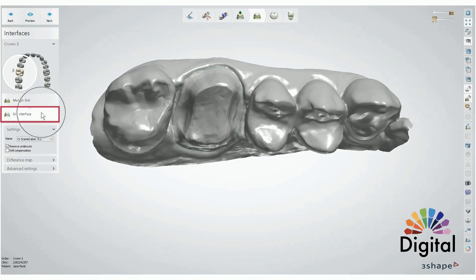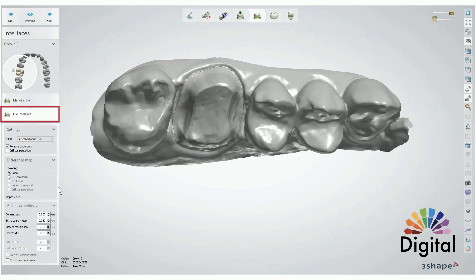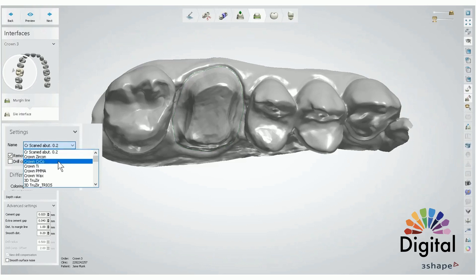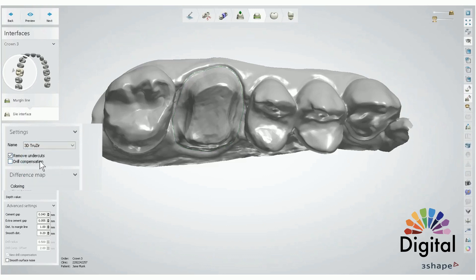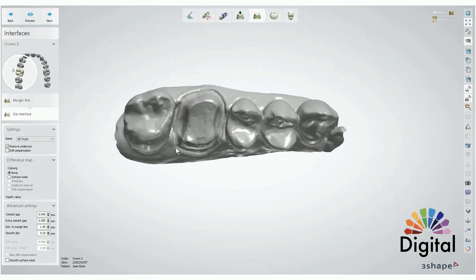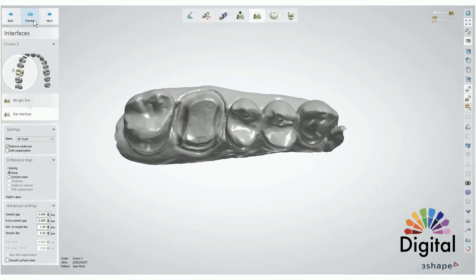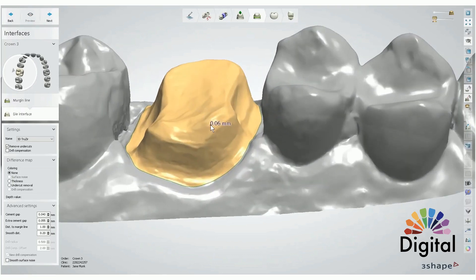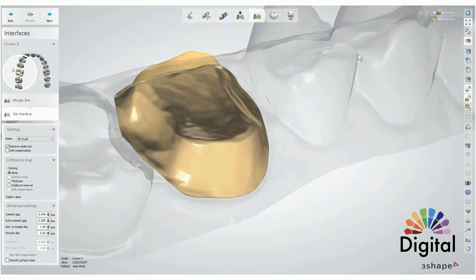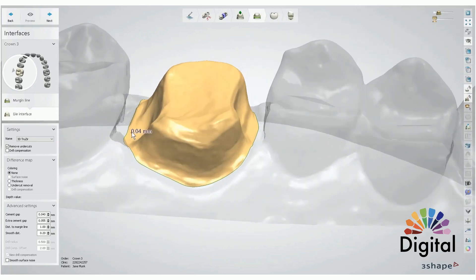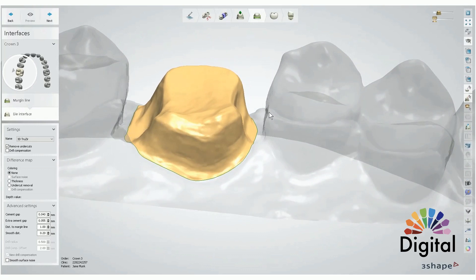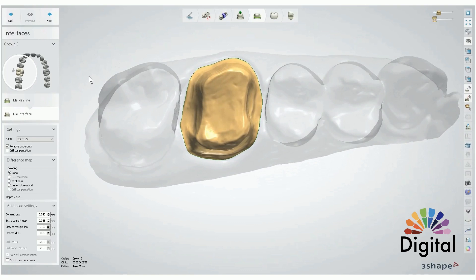We are in Die Interfaces. Die Interface is usually preset when we set up the order form, but if we made a mistake or want to change the material, we can change it here. Click Preview — the interface means the system applies some cement space between the scan and the crown. We have a thin layer right on top of the prep, and the crown design is going to be created on top of that. Let's go next.